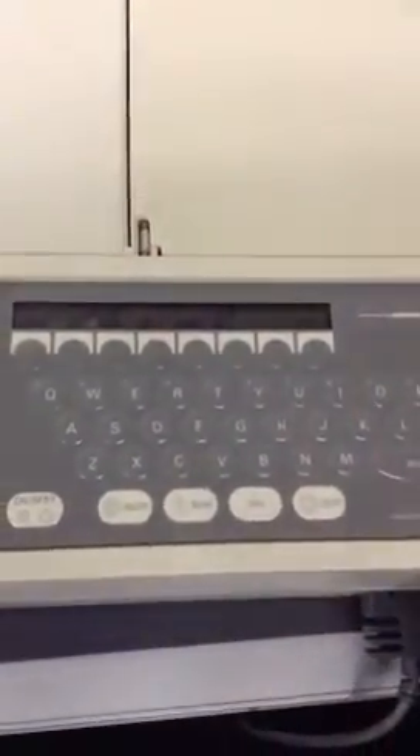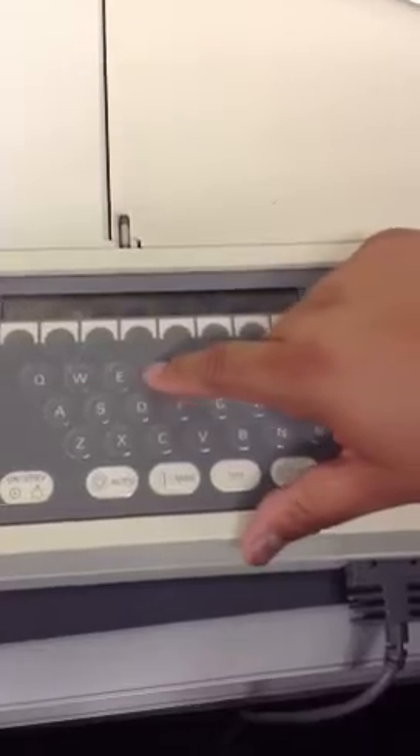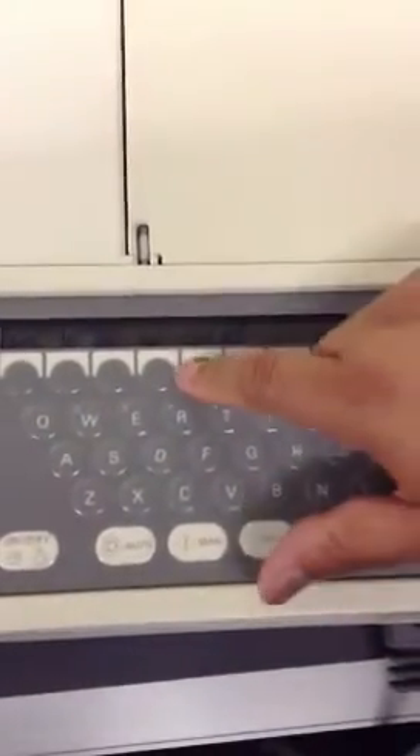You'll hear the little beep, and you'll see that it actually starts to ask: is the RPH the same as printed marking? Just hit return, and now you come to the main menu. On the main menu, it's going to say main and patient. Press the patient button first, which takes you to the patient menu, and we're going to click on the name. This is where we free type the patient's name — I'll put my name: Salinas, Carlos. Once the name is in and spelled correctly, hit return, then click on the age. We'll say the patient is four years old, and return. Now put in the sex of the patient — male, M for male — and hit return. We're always hitting return going back to the main menu. Now that the patient data is in, we'll hit return and go back to the main menu, and that sets us up to begin running the EKG.